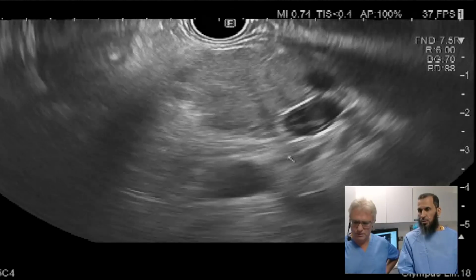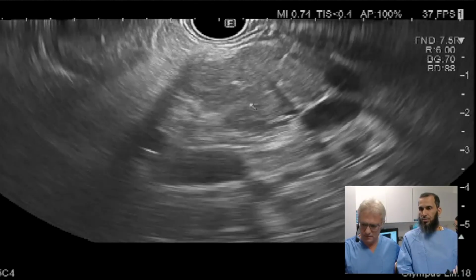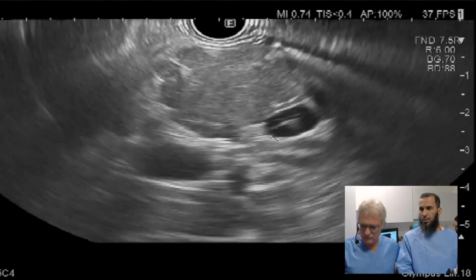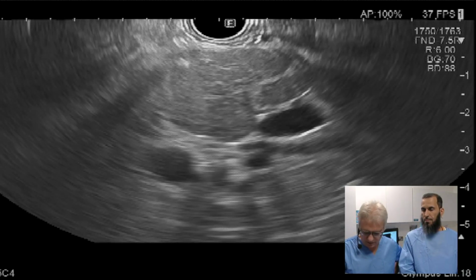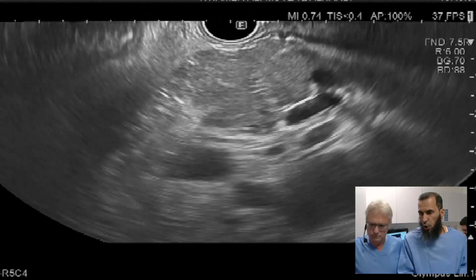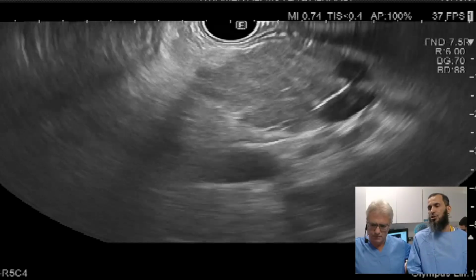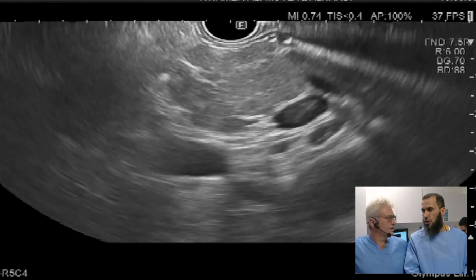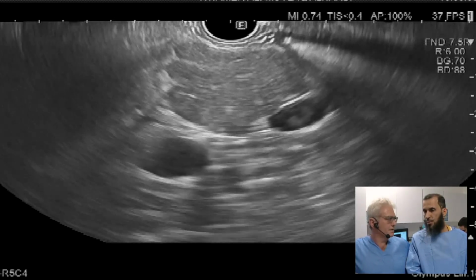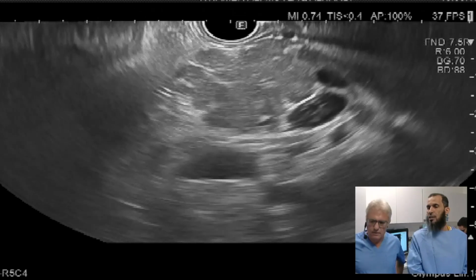It seems abnormal. It seems there are hyperechoic foci. I don't see the duct, or at least the duct is very small. So it's kind of sausage-like, you see, the duct appears and disappears. Yes, so this is looking for either chronicity from the recurrent attacks of pancreatitis or maybe another etiology. Now, we entertain that one of the etiologies could be autoimmune pancreatitis. It's also strange that in chronic pancreatitis, there's no minimal duct dilation, no? Yes, exactly. So now there's lobularity, a large pancreas.